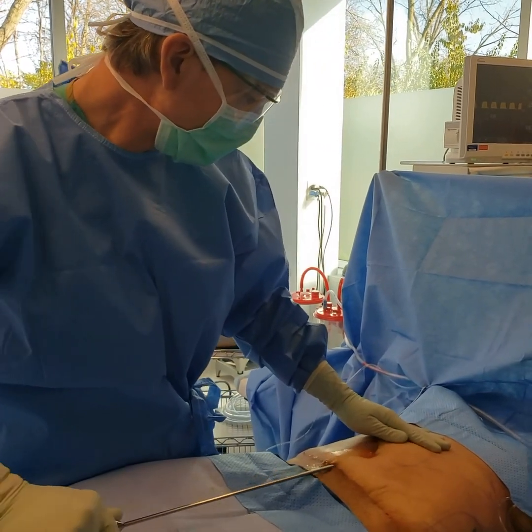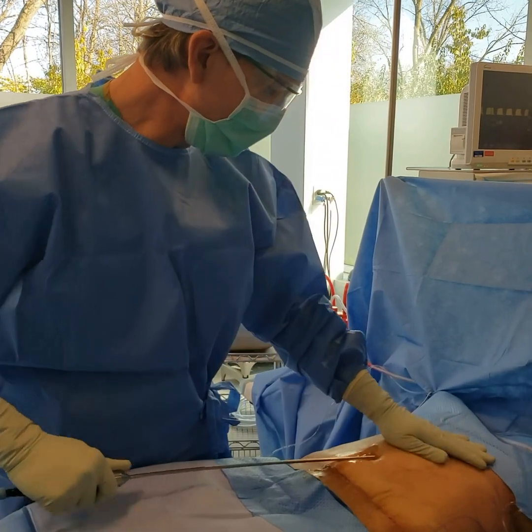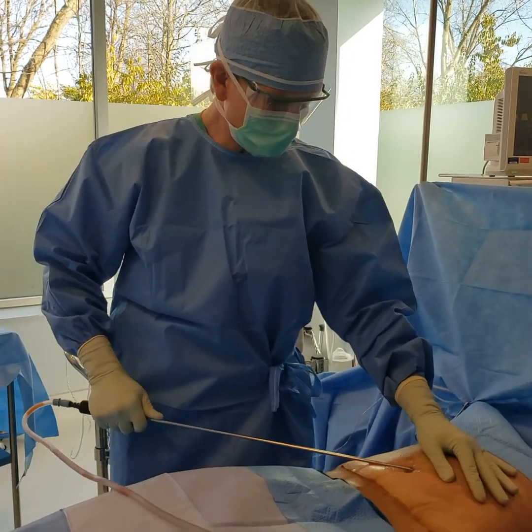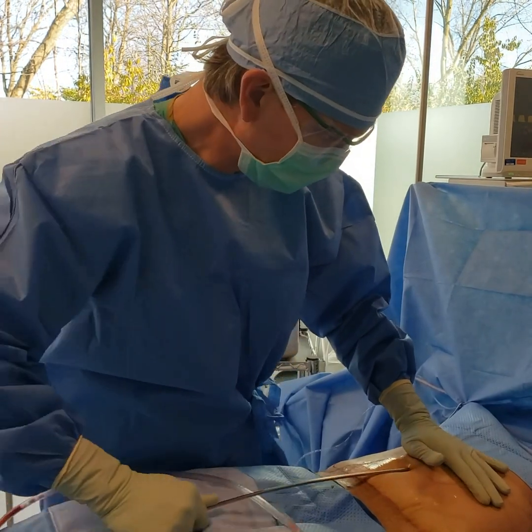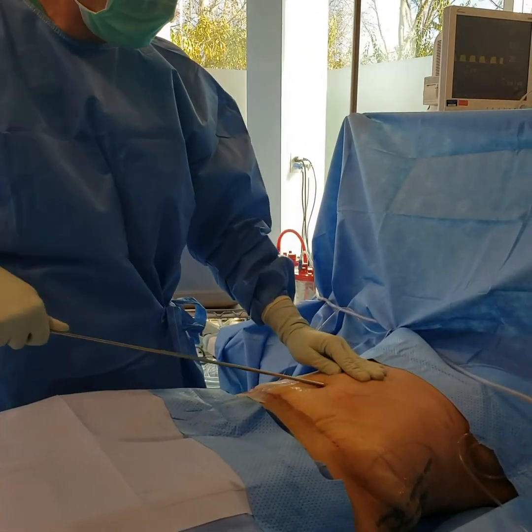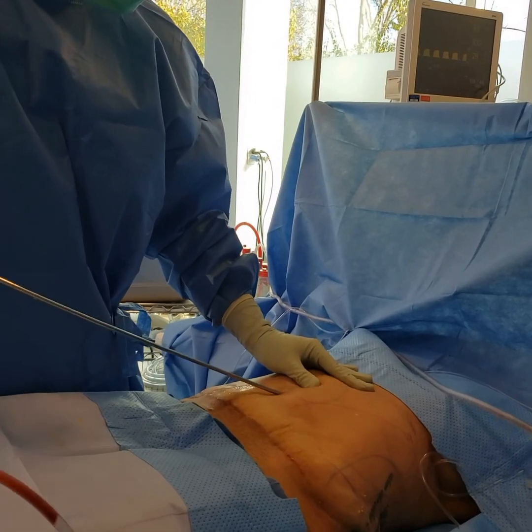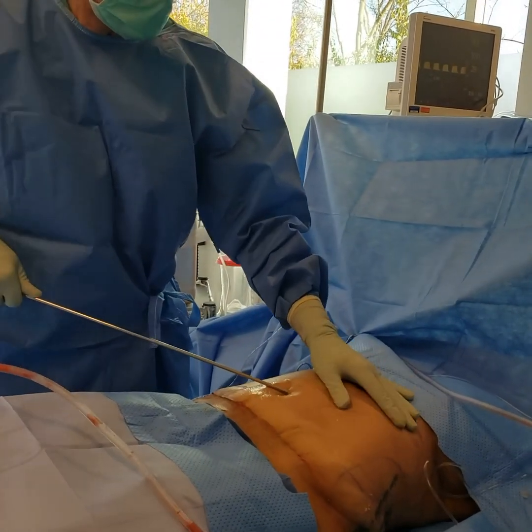But it's a little tedious because we're just going round and round, hitting all the areas, and you want to keep doing it until there's almost no resistance. I can feel it right up here against the skin even. I'm trying to break it up right along the skin surface here. And this part in particular I want to focus on because she was left with a big bulge, which really made her look abnormal.